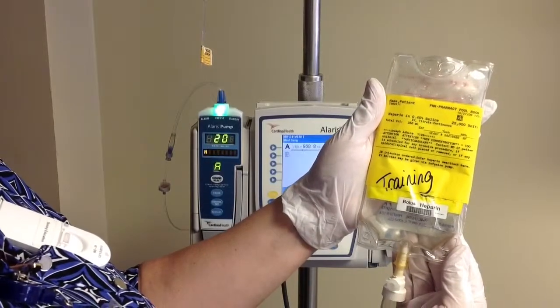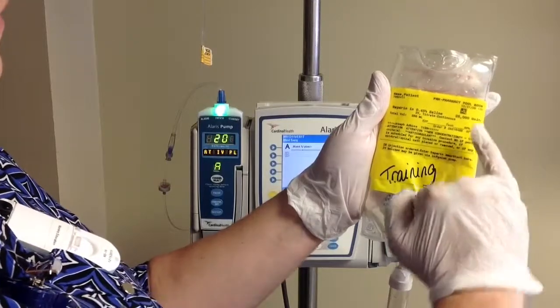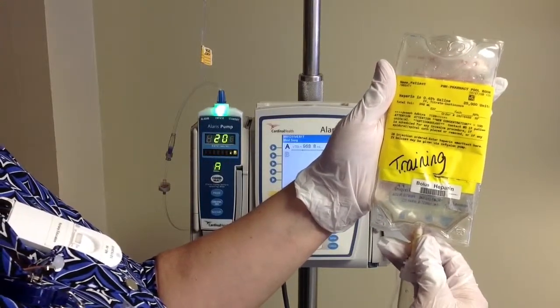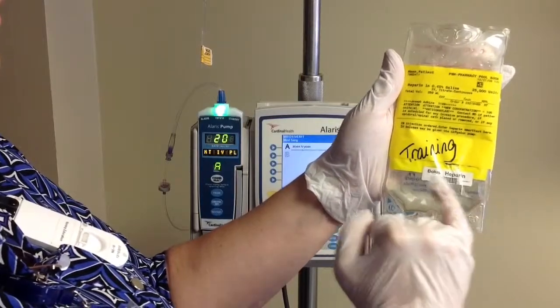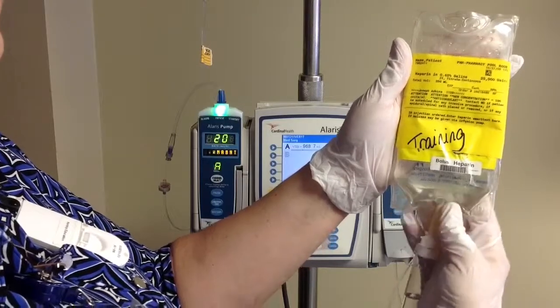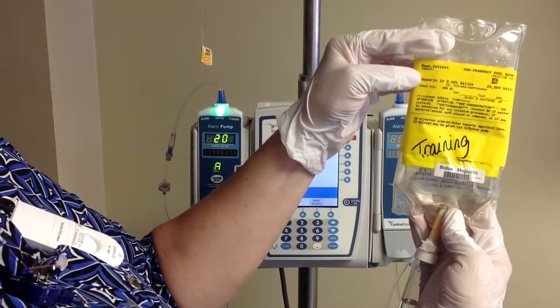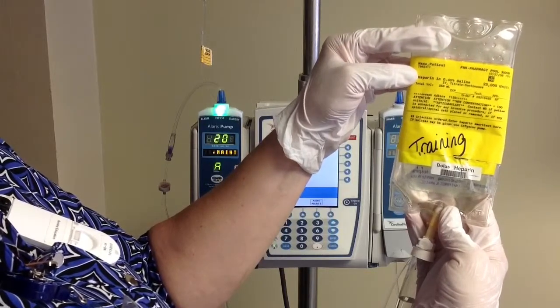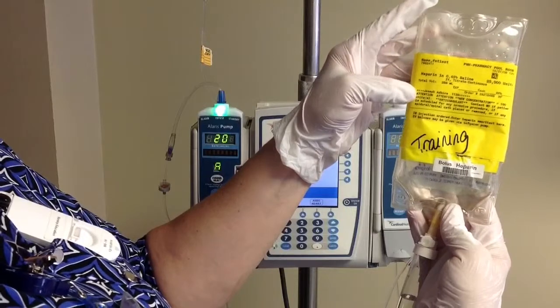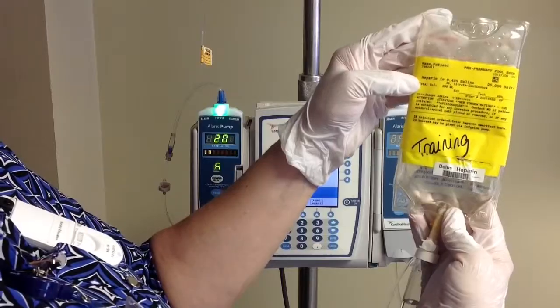Before we hang our heparin, let's take a quick look at the anatomy of the bag. Up in the upper right-hand corner is your 2D barcode that you're going to use for scanning your continuous infusion. Along the bottom of the bag there is our bolus barcode scanner, and you're going to use that for any of the PRN boluses that you're going to give. Note that we have a standard concentration we use in the hospital — 25,000 units in 250 mils. Having that high, standardized concentration allows us to bolus from the bag and eliminate a lot of the potential errors that would happen.